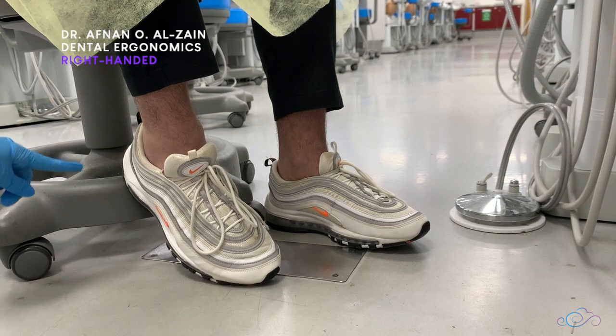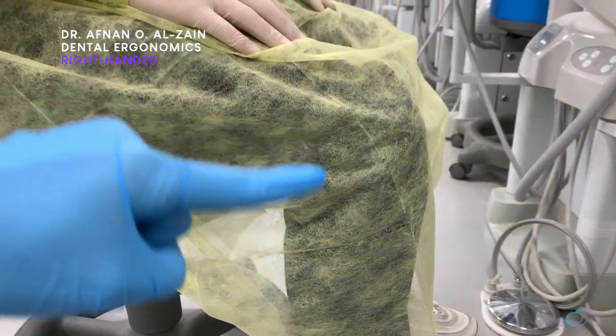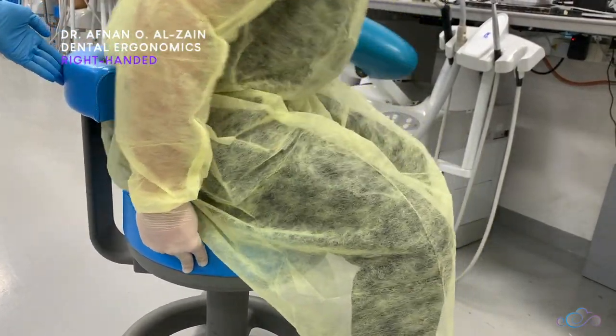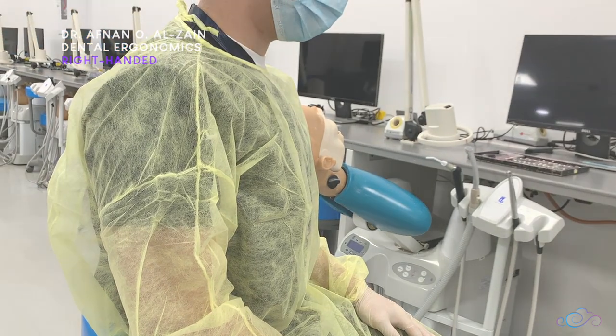When sitting in position, you have to make sure that your feet are flat on the floor at a right angle with your leg, and your legs are at a right angle with your thighs. You sit completely back on the seat to rest your back, making sure that your back is straight with your shoulders back.